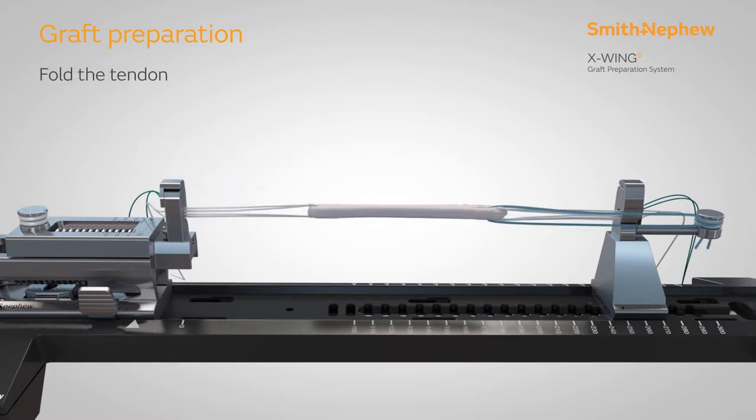Thread the tendon through the second ultra button and fold to create a quadrupled construct. Secure any free suture ends around the suture management post to hold in place. Place sutures at four points along the length of the construct according to your preference.